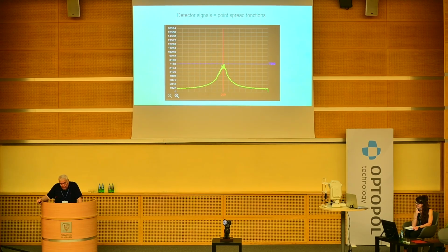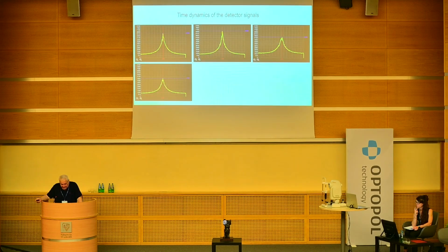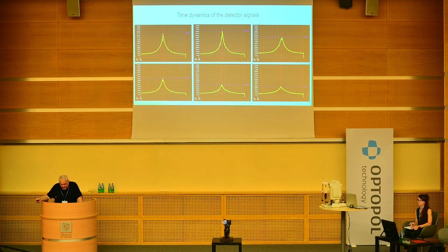So you may follow either the coordinate or the level of the signal. In the sequence of the signals, you will see that they change in the coordinates. Look, red readings are changing. Red line, it's the maximum. It's, I would say, varying.